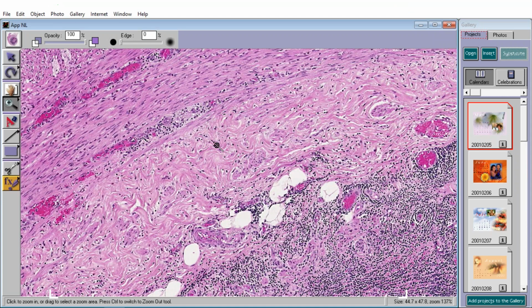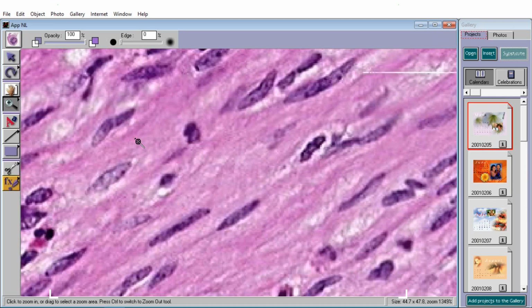Now, do you remember one of the main layers of every gastrointestinal tubular organ is the muscularis? So look, you have a bunch of really, really nice, normal, spindly, smooth muscle cells here.